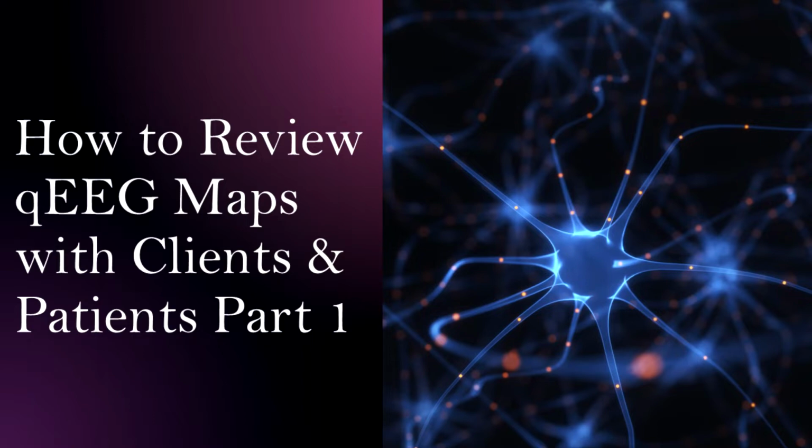So tonight, we were asked last week if we would talk about how we talk to our patients, how we go over a map and interpret maps with patients and clients. It was a popular enough topic that we're going to try and record this. We'll see how the recording comes out. So, try to keep your background noise down or we will mute you. And anybody can chime into this.